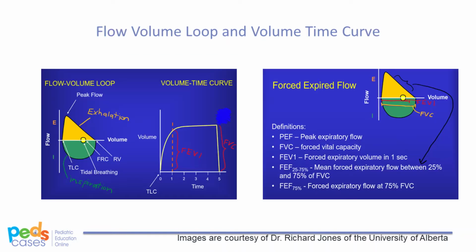With spirometry, the key maneuver is the forced vital capacity maneuver. There are 4 steps in this maneuver. The patient starts off with regular tidal breathing, just like we're all doing at rest right now. Now remember that with regular tidal breathing, the volume of air in our lungs corresponds to our functional residual capacity. The subject then takes a rapid, big breath to achieve a maximal inspiration, so now their lung is at their total lung capacity.